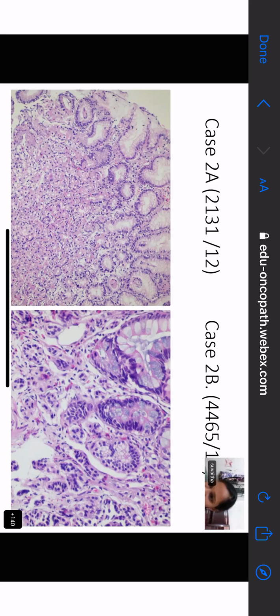Anything else? Sweta? Jimmy? Anything else? Dia? Ma'am, I can see one nest. Ma'am, I can annotate that. Yes, please annotate. You can see a nest. Is there just one nest? There are many nests beside it, and ma'am, they are having.